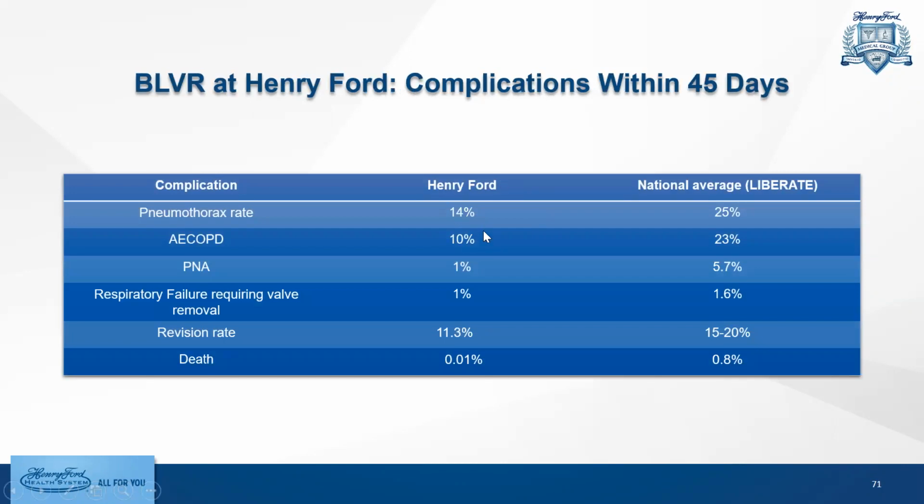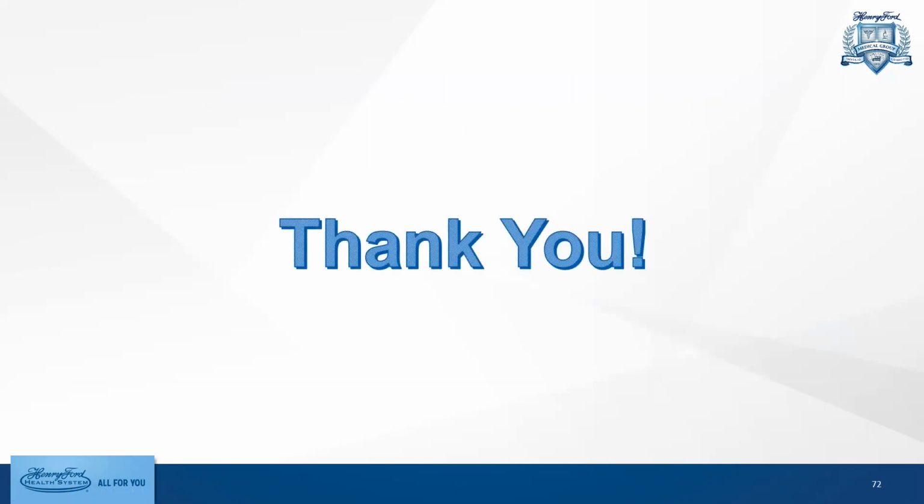Complications, again, you're thinking pneumothorax. This is why our patients travel with a pneumothorax kit. However, in comparison to LIBERATE, we had less pneumothorax. Acute exacerbation of COPD, 10%. And we started a protocol where we give them prednisone, which can decrease COPD exacerbations after valve insertion. And thank you all.